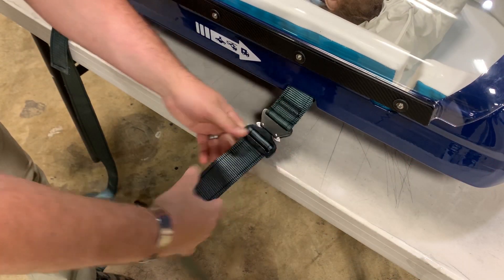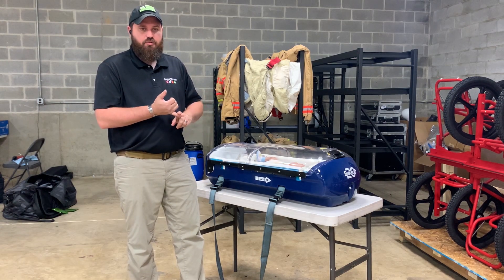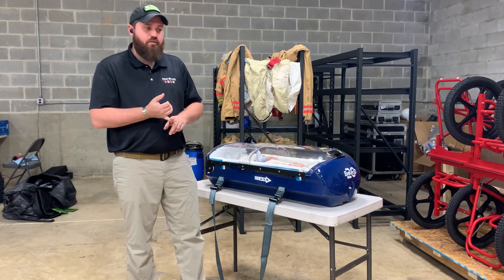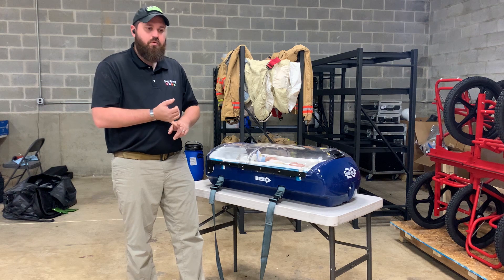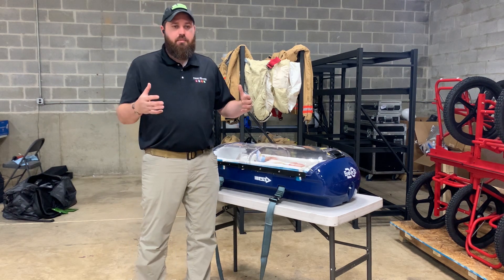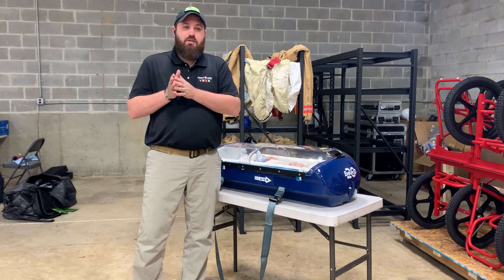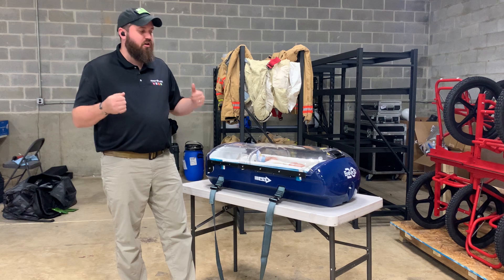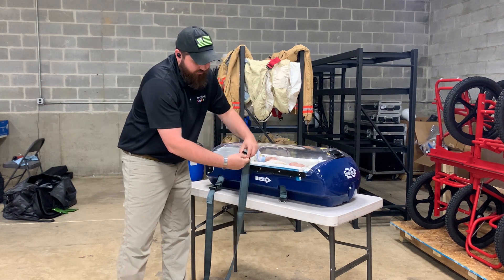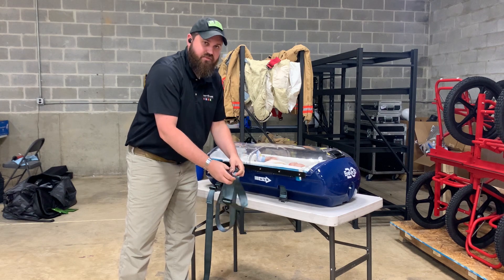You also have the external straps — a 20G aircraft-style buckle used to attach the BabyPod. It can be attached to a Ferno litter or Stryker cart inside the ambulance, which is the preferred method for ground transport. They can be buckled into an aircraft, strapped to a spine board or patient transfer board for hospital evacuation, or even crossed and looped over your head to hand-carry the BabyPod. This is very useful when transferring from a ground ambulance to a helicopter, or when crossing rough or wet terrain where wheeling a cart is difficult. A single person can carry it, which is very important. The straps have a simple buckle and release, are adjustable, and you can even thread a standard seatbelt buckle onto them to secure the device under the bench seat of an ambulance.